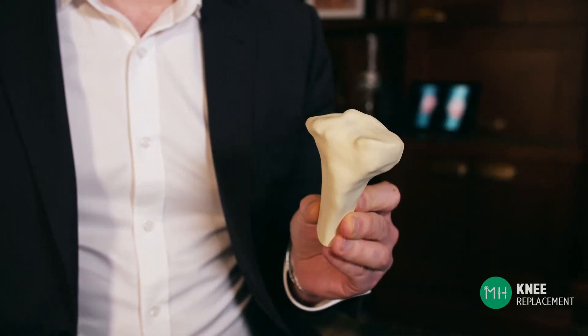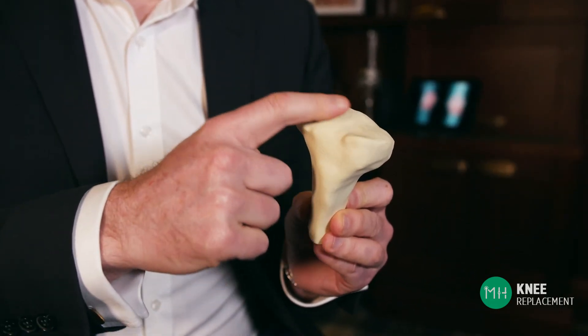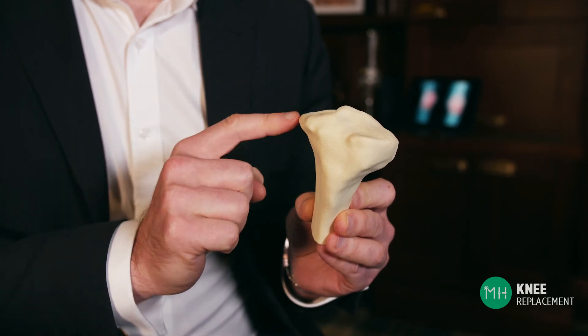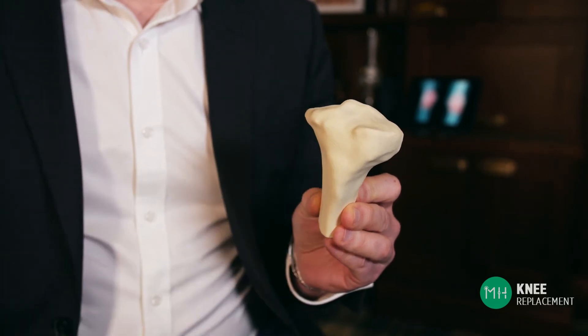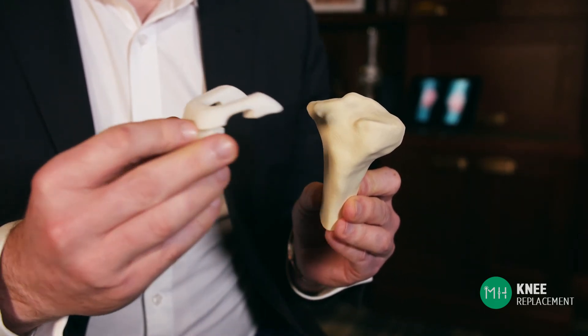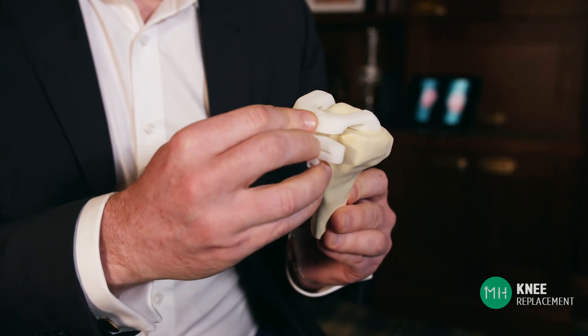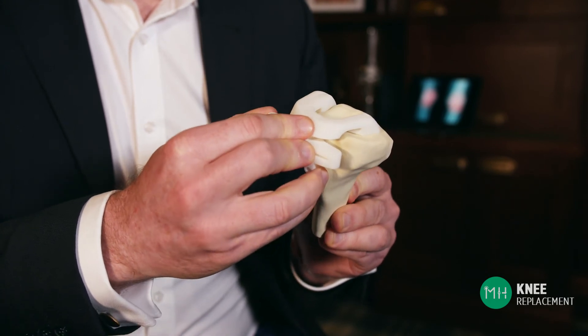We use exactly the same principle on the shin bone as we did on the thigh bone. There's the shin bone of the knee joint and there's the guide securely fitting on and matching that patient's knee.